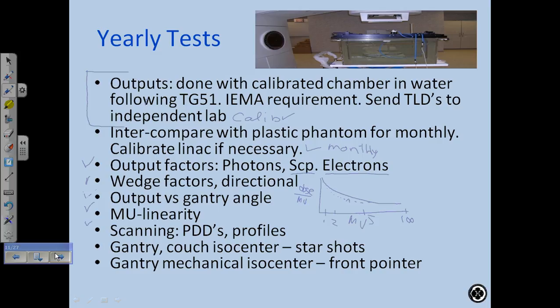What can affect PDD? Energy. So if your energy drifts, your PDD is going to drift. Another thing too, what I found on a machine that was overheating. You know what a chiller is? It's this thing that cools water. A lot of hospitals have them for air conditioning. And they run chilled water through the hospital. Well, we tap off that chiller and we feed the Linac with the chiller water.